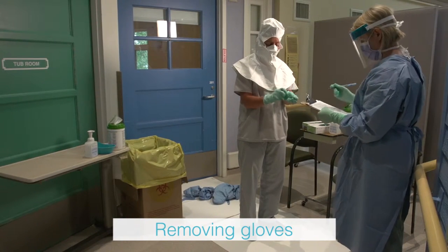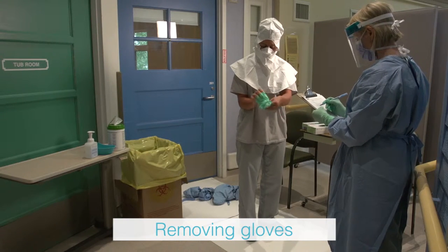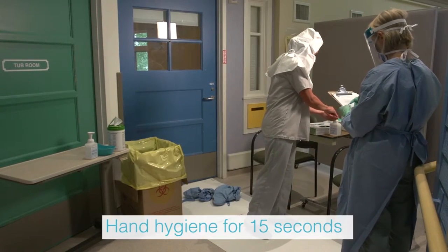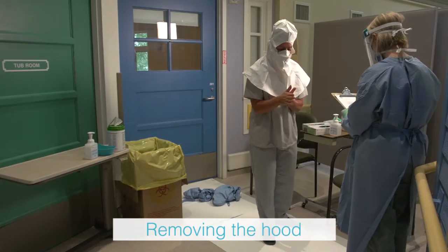The health care provider removes the inner glove by grasping the outside edge near the wrist and peeling away, rolling the glove inside out. Slide one or two fingers under the wrist of the remaining glove and peel away. Discard immediately into the waste receptacle. Perform hand hygiene using alcohol-based hand rub and allow hands to dry completely.